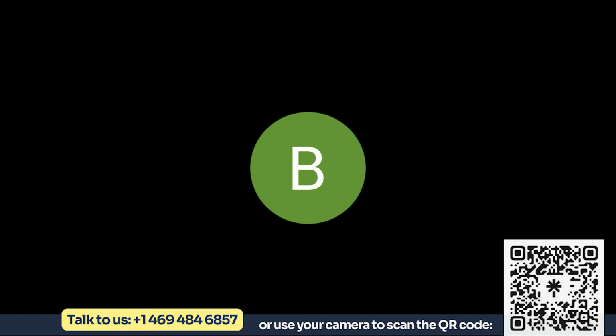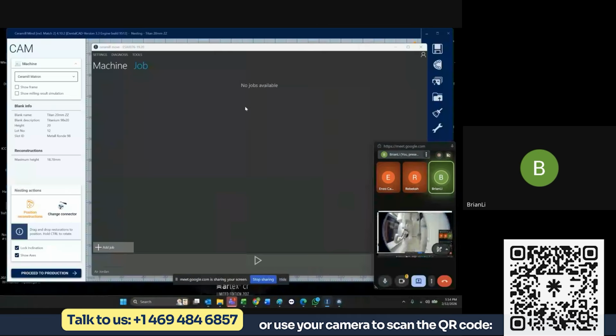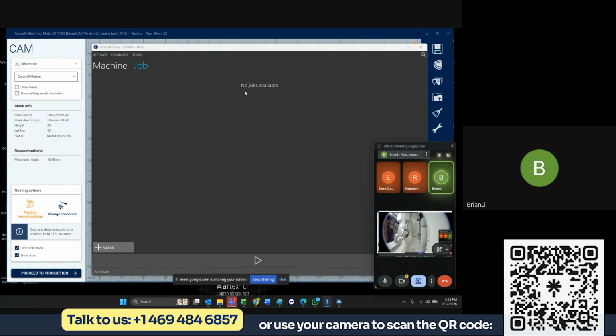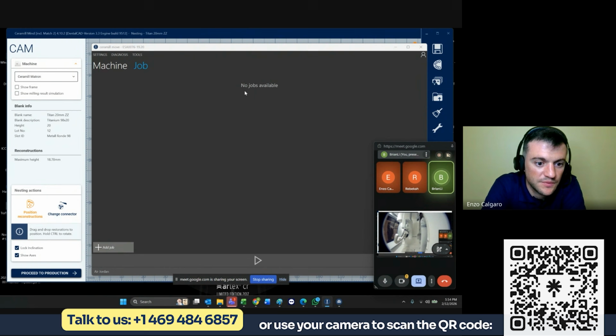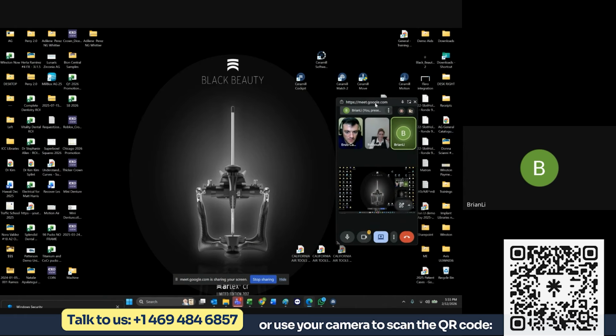Okay, so let's go back. Am I on? Okay, let's close that. Close that. So here, after this has been calculated, I'll right click. Brian, we're stuck on the screen. Oh, why is that? Let me close it. It's stuck. Okay, there we go.